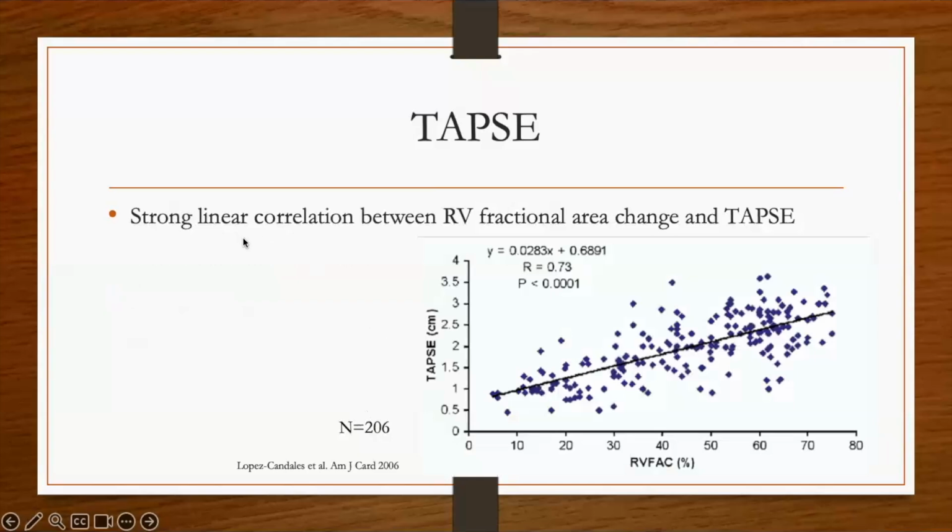Another study that looked at the correlation between right ventricular fractional area change and the TAPSE basically showed that there was a correlation. There's a lot of data points in here, but if you can imagine TAPSE of 17 being right about here and draw a horizontal line across, you can see that most of the subjects with higher fractional area change also had a higher TAPSE, and most of them with lower TAPSE also had a lower fractional area change, kind of dividing this curve into 4 quadrants.